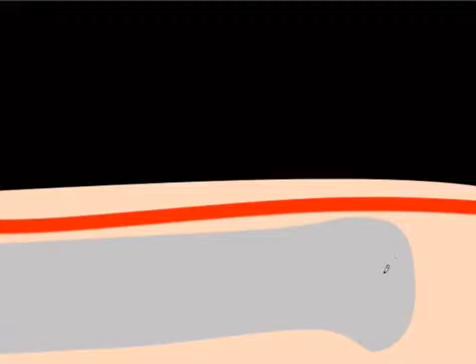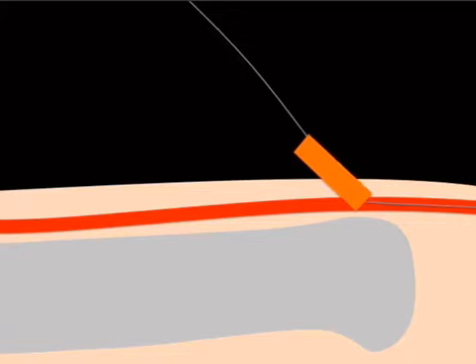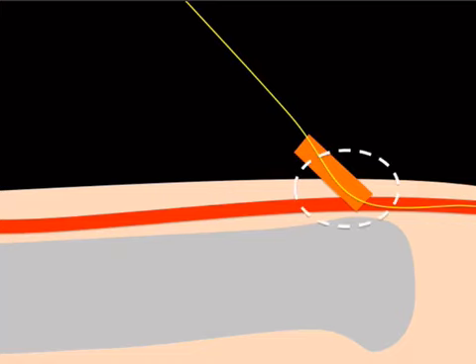So something like this. This is our femur, this is our femoral head. We're looking at it from the side. This is our vessel running on top of it. So we're going to stick right here, and we're going to get a flash, and then we're going to put a wire down through that thing, right? Pull the needle out. And then we're going to put our sheath in, right? And take the wire out, and then you can put your different kinds of long wires and stuff in there. So how big was the hole?